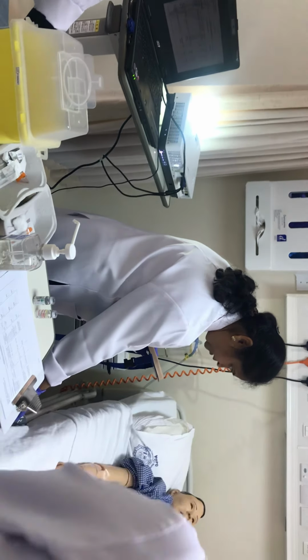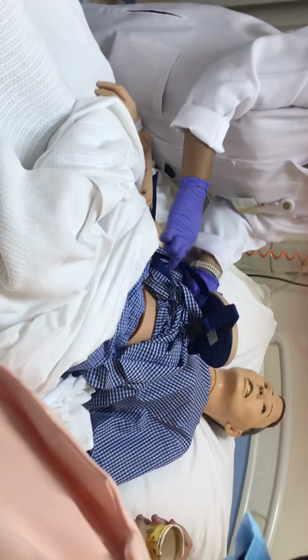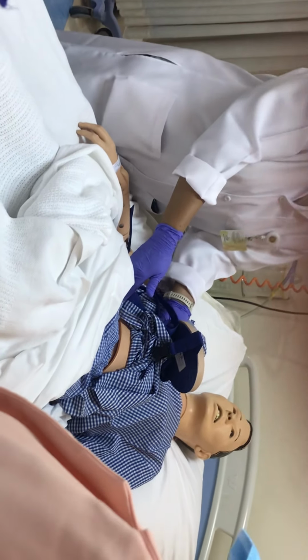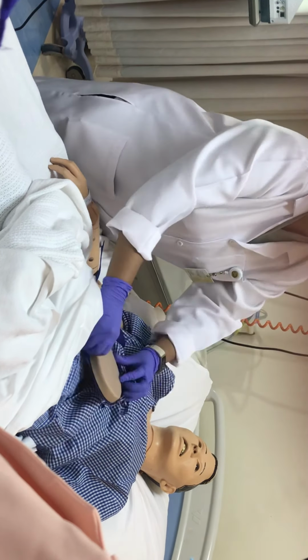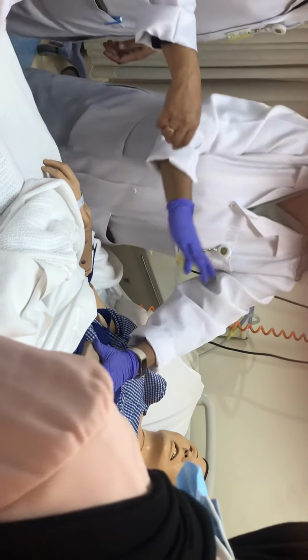Okay, so 10, 10 plus 10 we are going to give. Follow all the other steps and then make the students fix this very well. If you want them to show you, you can tell them this is the navel. So 2.5 centimeter they should not give. Last dose was on the left side. So now we are going to give on the right side. All that you can make them explain. And it's better to fix it in this direction, not like this. So you can see that they are fixing. Simply hold it for me now.